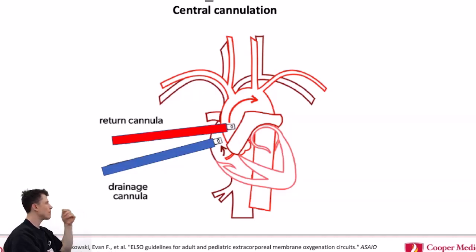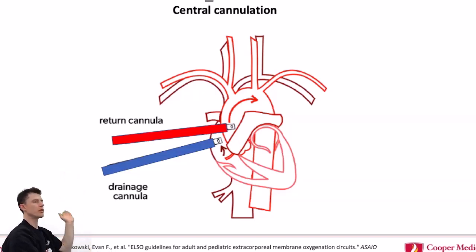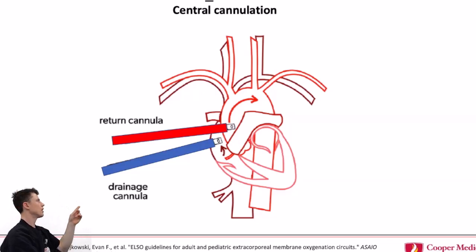And so this has some benefits. We talked about how on the last slide the blood flow is going up the aorta, kind of backwards and against the heart. This goes with the heart, so it doesn't really compete against the native heart function. And also, we'll talk about some other reasons, but it perfuses all the vessels of the upper body very easily. But what adds complexity is bleeding, central access, it's very invasive. And so not one we typically go to as a first line. Now kids, this is often what they go to first line.